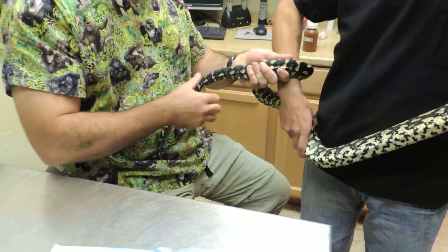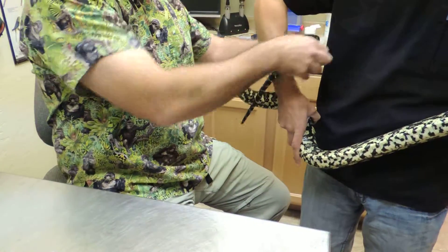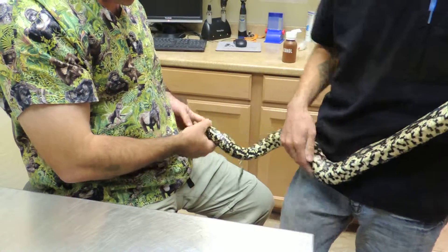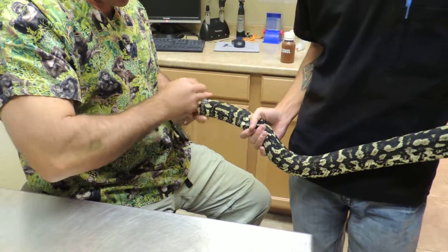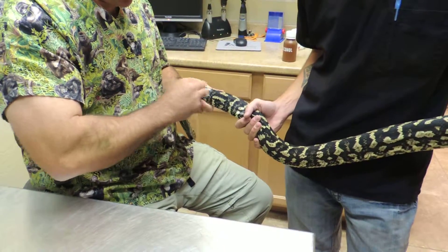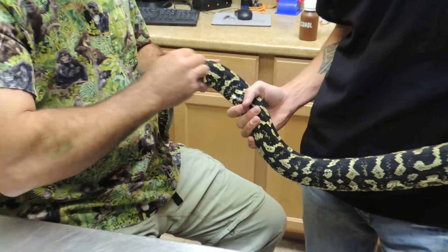You got a video? Okay. So with snakes, because you're dealing with sometimes venomous animals and want to stay away from the mouth, it probably is best to do it in the back part of the snake.